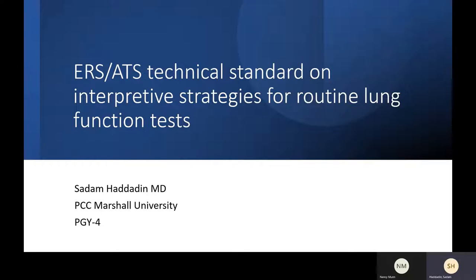Make sense? I don't recall the name of this line. But this is very important, because we need the FVC and other numbers, but the FEV1 is very important, and the FEV1 is how much you blow in the first second. So if you hesitate in the first second, then the whole test is out. Because you may blow slowly, slowly, slowly, and then take off, and in the end you will reach the FVC, but you will get an FEV1 which is very, very low because your start was not right.